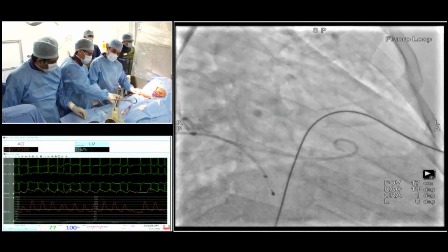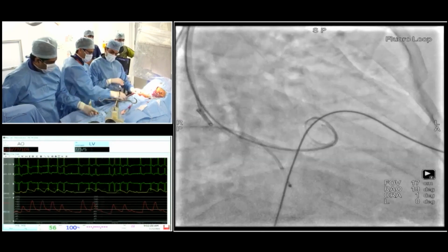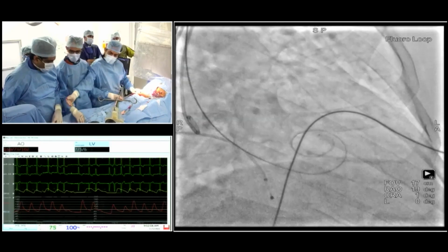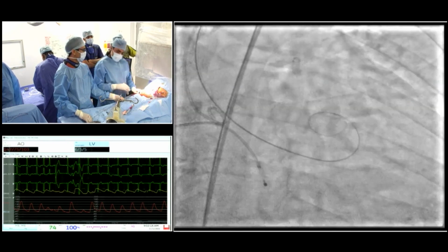While you're getting along, Ravinder, do you use the single wire unipolar pacing to avoid another venous stick at all? Do you ever use that? So occasionally, in one or two live cases we have done that, but let me tell you, I'm not very comfortable with that. So I've switched to totally, I would put a venous line and put a pacemaker.